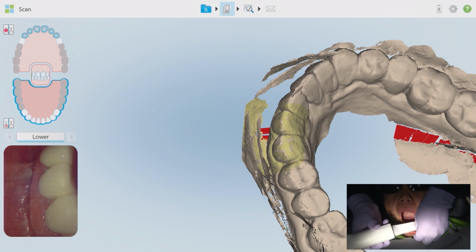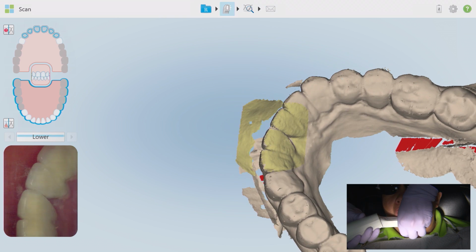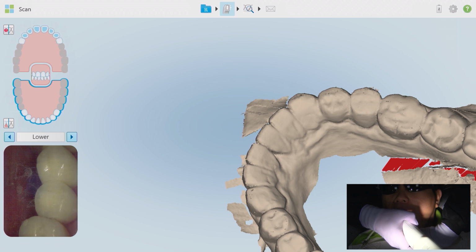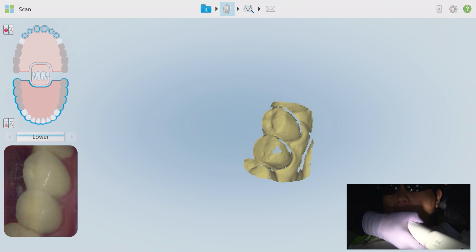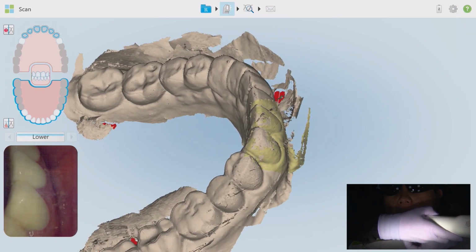Start with the wand on the incisal edge of either cuspid area and rock from incisal to lingual and then to the buccal. Stop this scan and move to the contralateral side where the motion is replicated. Each of these incisal edge detail scans should take no more than 5 seconds each to acquire.